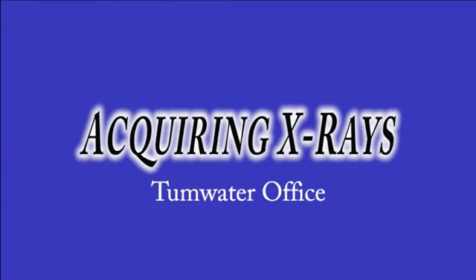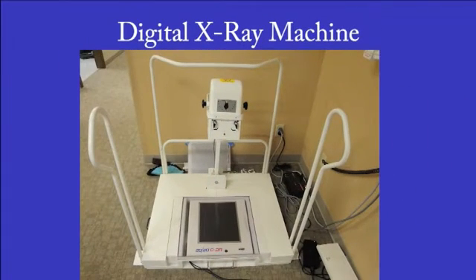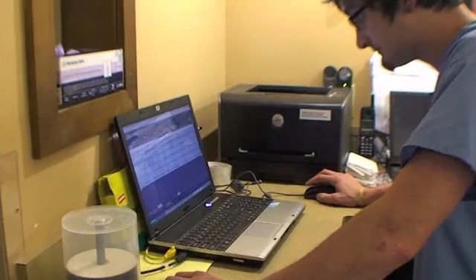X-rays in the Centralia office will focus our attention to the Tumwater office. Our Tumwater office uses a digital X-ray system. This makes the work of taking X-rays much easier and cuts the need for a developer, films, and multiple cassettes. The system is computerized and is run by a laptop found at the nurse's station next to the X-ray machine.